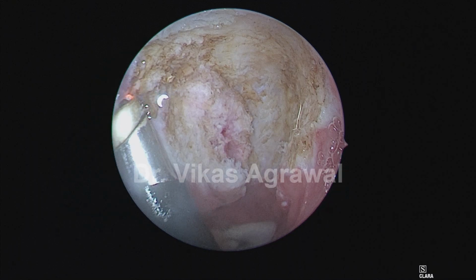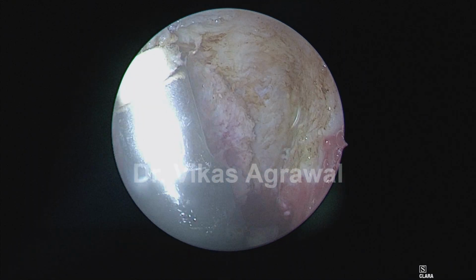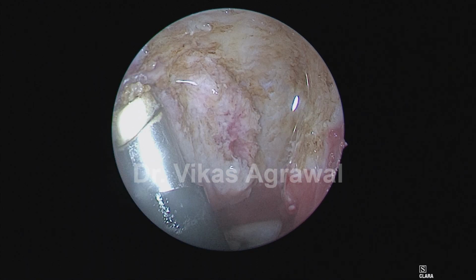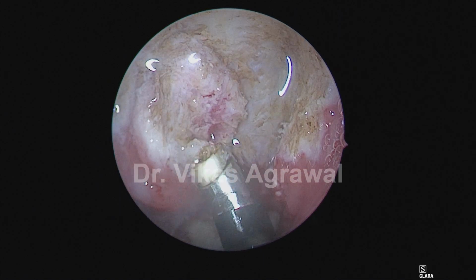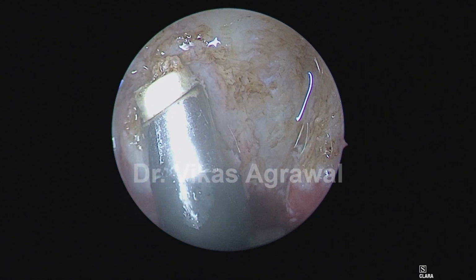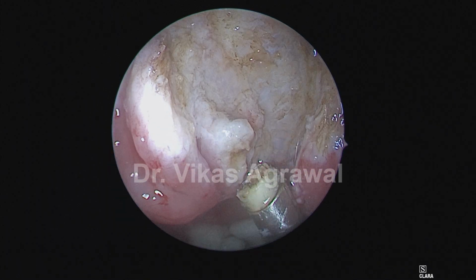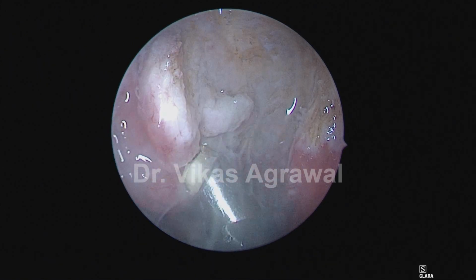If you keep on going in and going out, then you damage the turbinate and the septal mucosa, and therefore we try not to move the scope in and out of the nose. So we'll do the same thing on the right side, but whatever I can finish from the left side itself, I'm trying to perform.